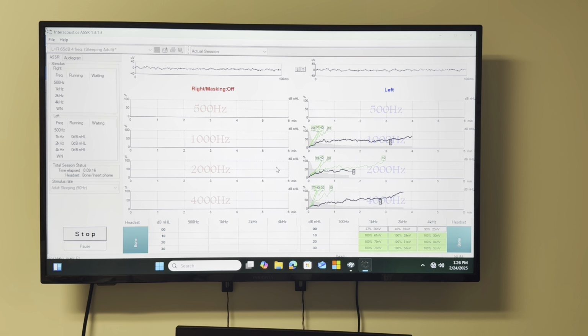Again, even though you see that stimulus artifact in the EEG, it would get cancelled out because it's using alternating polarity. So even in air conduction and bone conduction, it's using alternating polarity. So this wouldn't be good for diagnosing a mixed loss? Yeah, even the ABR is not very good.